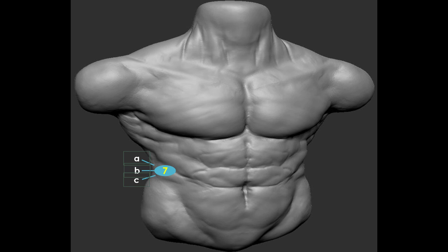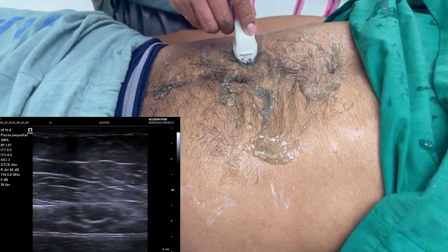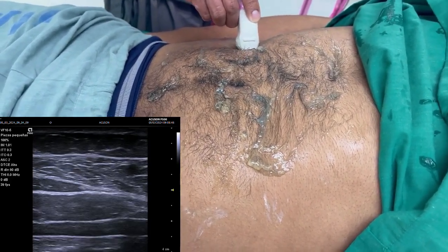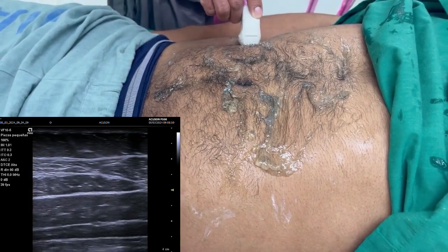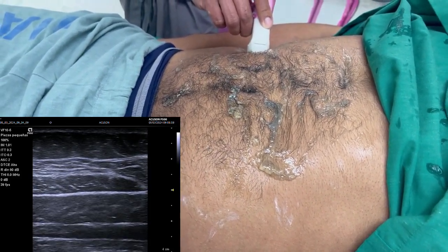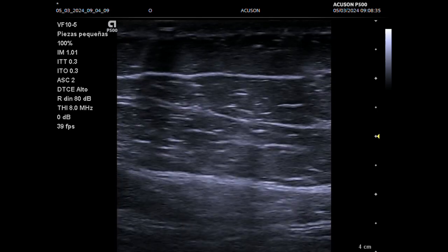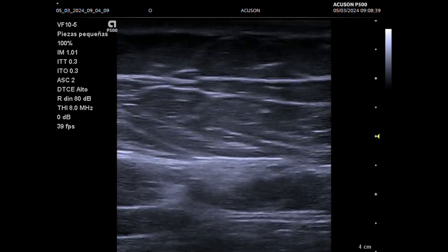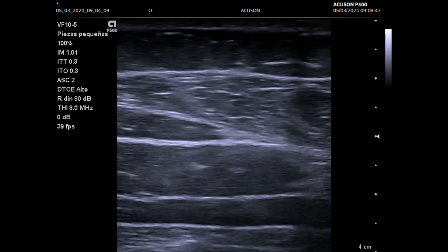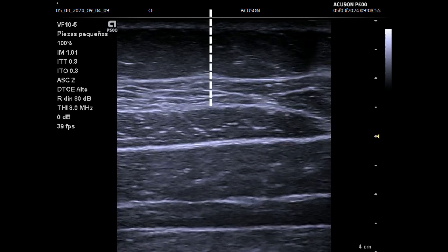In step 7, we locate the right rectus abdominal muscle at the umbilical level and move laterally to identify the muscles of the lateral abdominal wall. Here we measure the thickness of the subcutaneous fat and the thickness of the muscle package, which can help us decide the amount of botulinum toxins to use. We also measure the distance from the skin to the transverse abdominal muscle, and the distance from the skin to the transverse plane, which is a method we frequently use to apply a TAP block for postoperative analgesia.